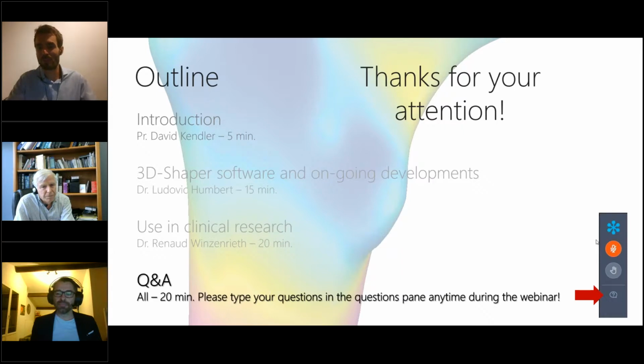Yeah, no, not yet. It's challenging for two reasons mainly. The first one is because the bone is not completely formed yet. You have some cartilage in some part of the bone, and the second one is to have access to the data. It would be complicated to do the same approach as the one that we did for the adult population because of the CT scan and the radiation dose for children.